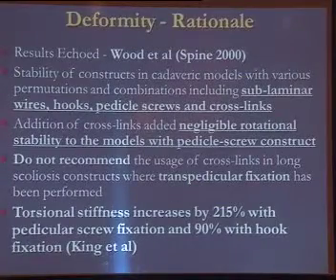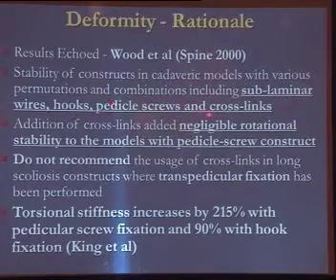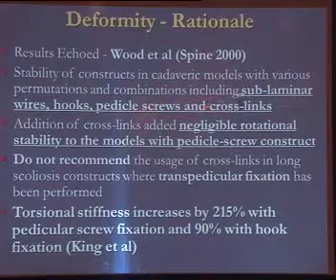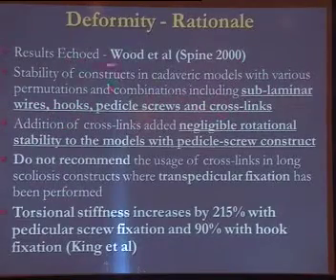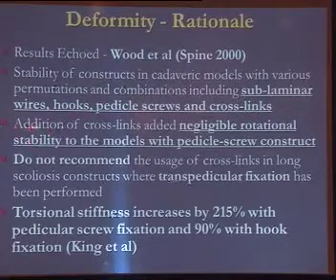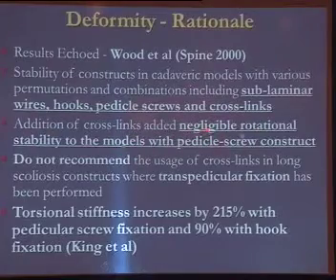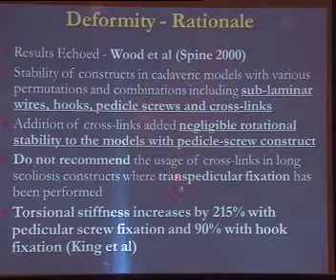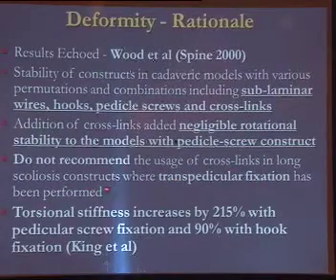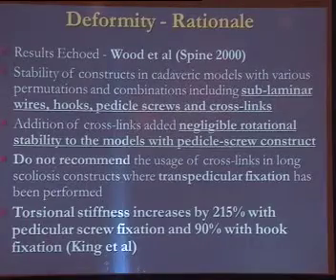So our results are echoed by Wood et al. The stability of constructs in cadaveric models with various permutations and combinations, including sublaminar wires, hooks, pedicle screws and crosslinks, were studied by this particular group. What did they say? They said that addition of crosslinks added negligible rotational stability to the models with pedicle screw constructs. They do not recommend the use of crosslinks in long scoliosis constructs where transpedicular fixation has been performed. Rotational stiffness increases by 215% with pedicle screw fixation and 90% with hook fixation.